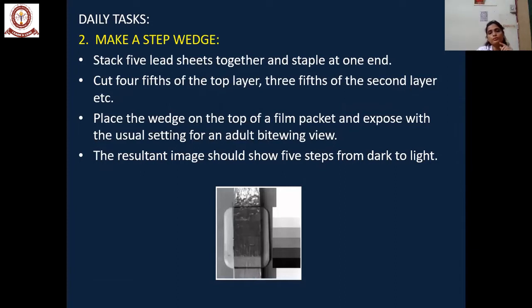And one more thing we can do is a step wedge. What do you mean by step wedge? We can take the lead sheets from the old exposed films.